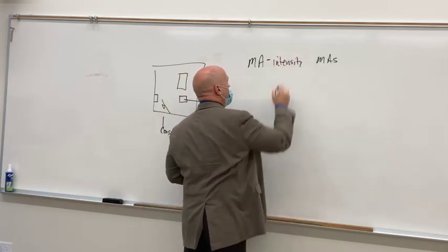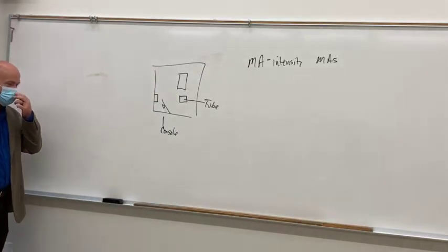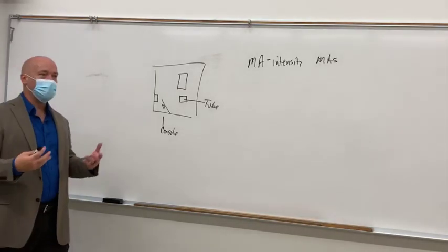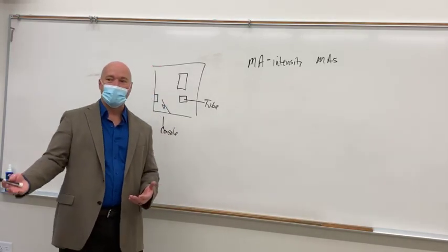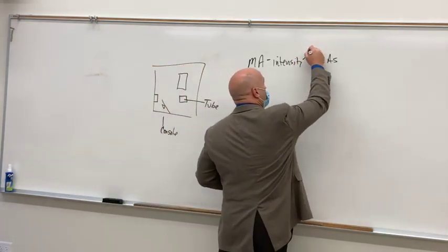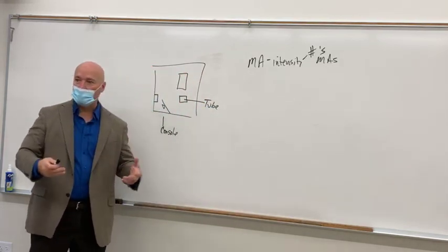And I struggled with this when I was a student, because I always thought of an intense kid as somebody who was just full of energy, and it just sounded like a powerful thing. But the power is actually the kVp in the x-ray beam. Intensity just means numbers in this context. It's just the numbers.